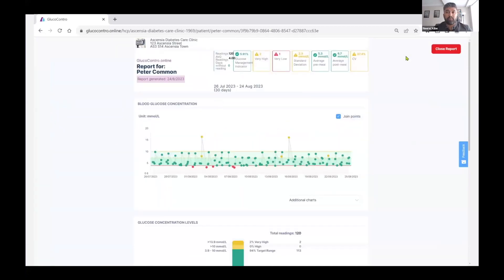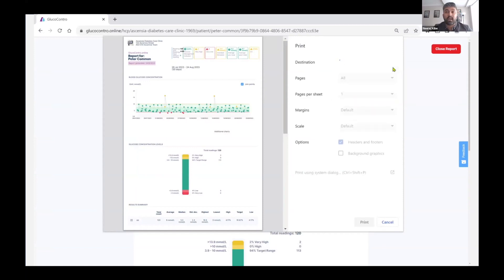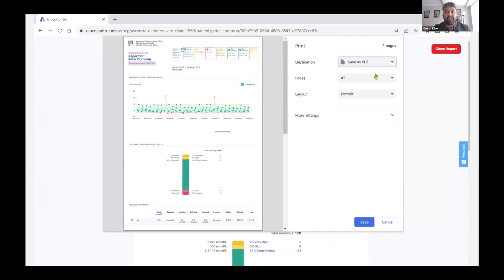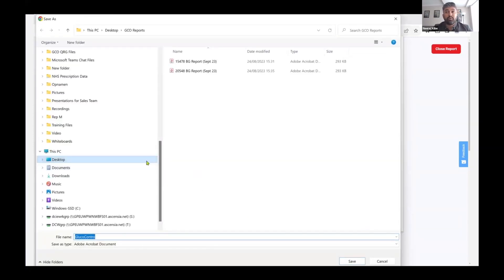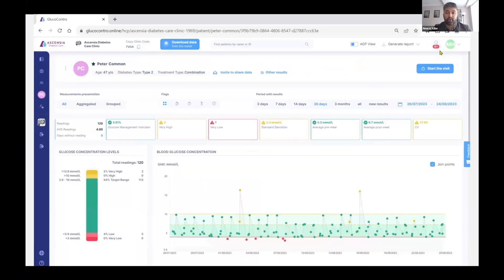It automatically opens the output mode, allowing you to either print it or create a PDF document. To print, select your printer and ensure it is set to colour printing, as the colour range indicators are a major feature across the Contour portfolio that can help with the interpretation of data, allowing you to engage with your patients. You would then click print. If you want a digital version, select 'Save as PDF' from the destination drop-down box, followed by clicking save. You would then select a suitable location and file name and click the save button. When complete, click 'Close Report' in the top right of the screen to return to the patient profile. It's that simple.